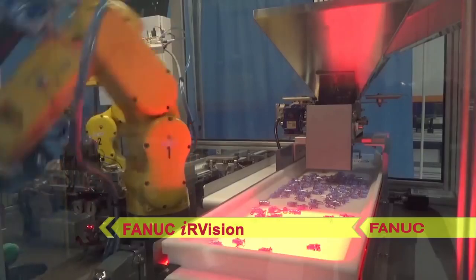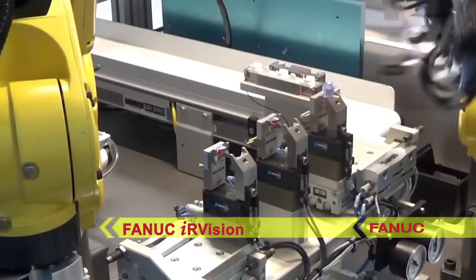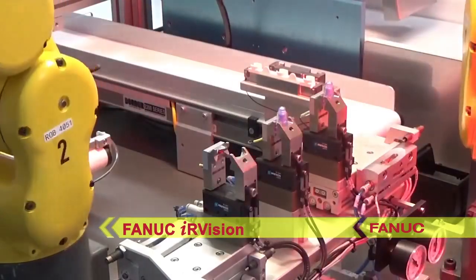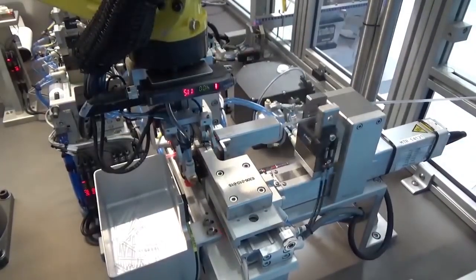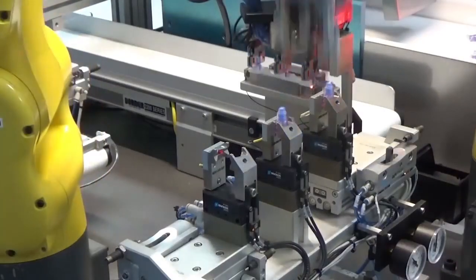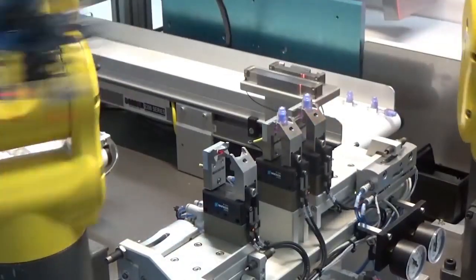FANUC IR Vision is used in combination with a flex feeding system in order for the robot to precisely pick valve parts from the feeding platform. Once picked from the platform, they can be placed into the assembly nest tooling in preparation for the insertion of the tubing.